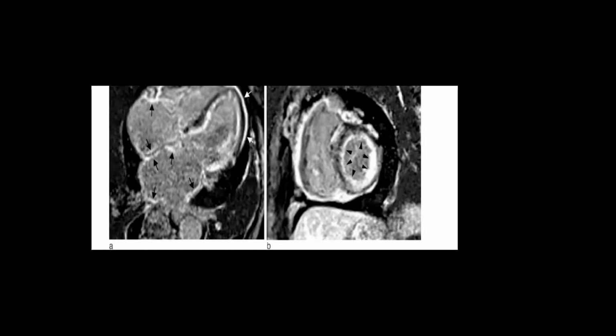Yes. And you see even the enhancement is spreading into the atria as well. So that is what? Amyloid, yes. Amyloid. This is so characteristic of amyloid. Very characteristic of amyloid.